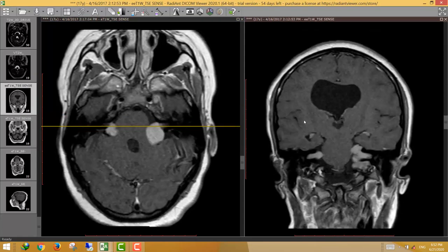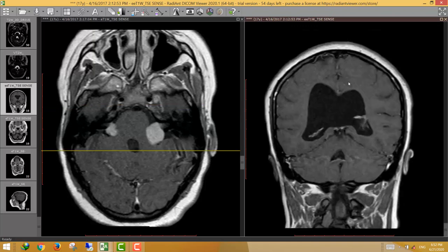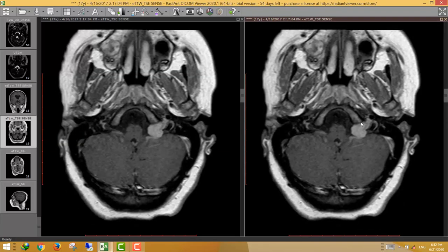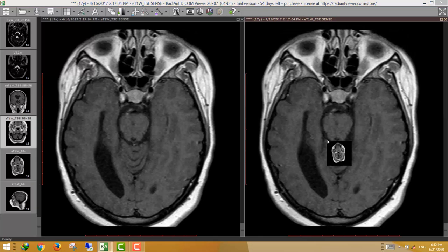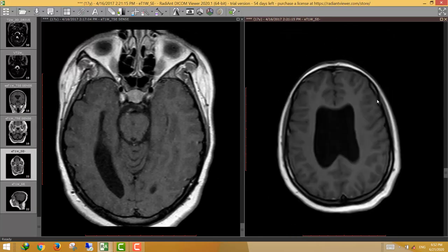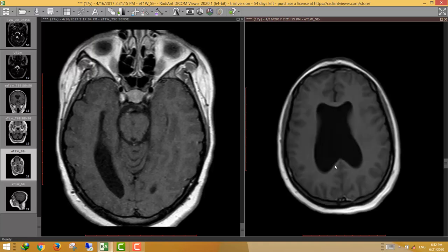Looking at the dural surfaces to exclude meningiomas, this patient does not have meningiomata — there are no meningiomas. We should also look for additional schwannomas from other cranial nerves.